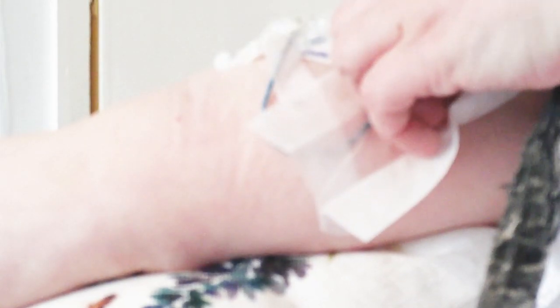So you clean it, but once you've touched this site, you never go back over that site with the same wipe. You just make sure that you don't go back over it, because obviously the bugs or whatever else on the rest of your arm, you're going to put back into the site of the line, which you really don't want.